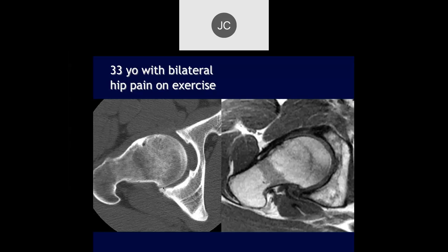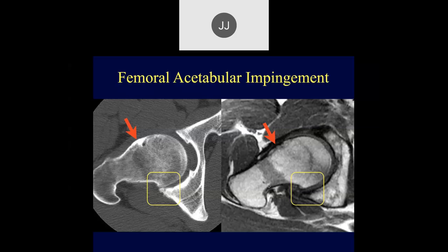We can also see abnormality posteriorly and inferiorly — cartilage narrowing, irregularity of subchondral bone, and marginal osteophytes. This is the typical appearance of pincer-type impingement. Most of these patients end up with a mixed form of both cam type, seen anteriorly, and pincer type. This is very characteristic appearance of FAI.